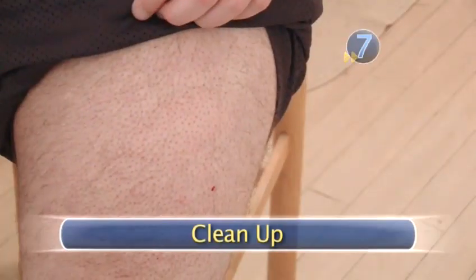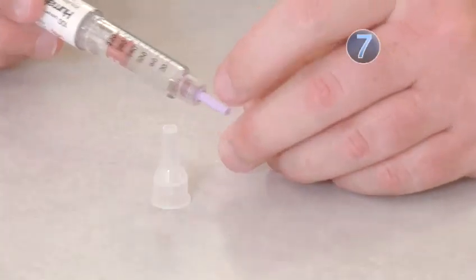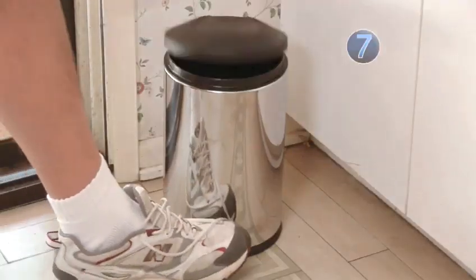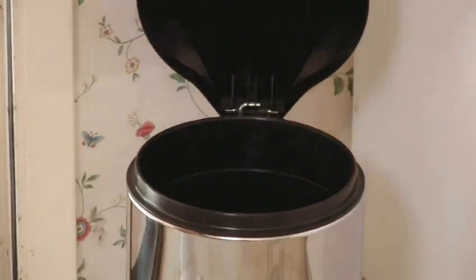Step 7. Clean up. Rub an alcohol pad over the site. Attach the outer needle shield to the pen, then unscrew the needle and throw it away in a hard-covered container. You're on your way to managing your diabetes.